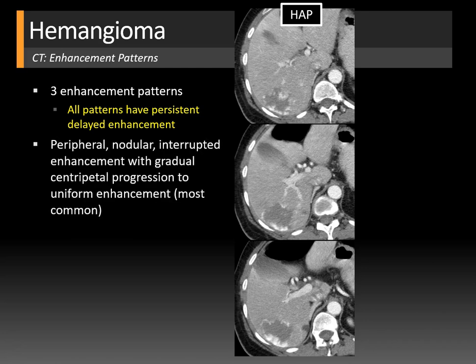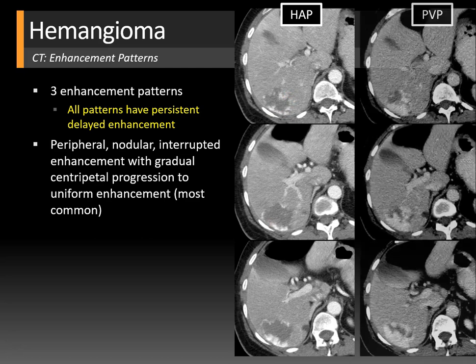The most common pattern is peripheral nodular interrupted enhancement with gradual centripetal progression to uniform enhancement. On a hepatic arterial phase image, the portal veins and hepatic artery enhance but the hepatic veins do not yet. There is irregular interrupted peripheral nodular enhancement. On a later portal venous phase image, the hemangioma starts to progressively enhance and coalesce, moving towards the center — very specific for hemangioma.